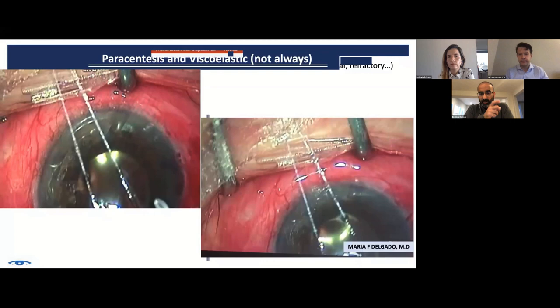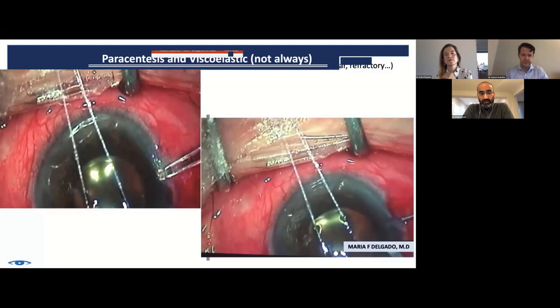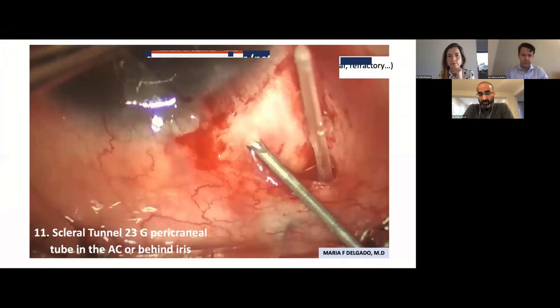I mean, some people are like, Nate, just fill the whole anterior chamber. Others might be a little bit more worried about it. If you're using Provisc, Viscoat, or even regular Healon, that is a little bit more cohesive, you're going to be fine. And we're talking about the valve devices, by the way, with the technique that we're mentioning. GV will result in significant spikes in many patients. So I would avoid using anything GV or above, like Healon 5.